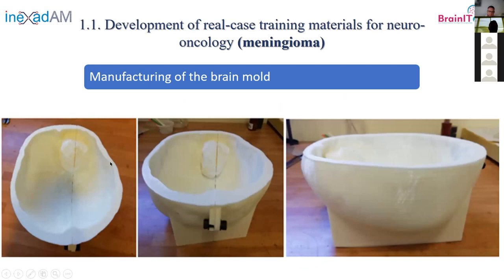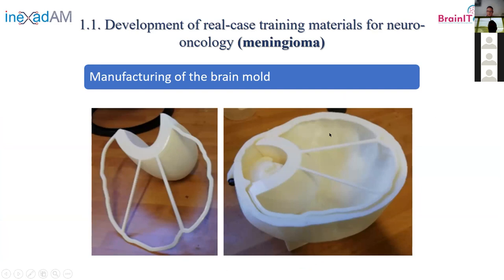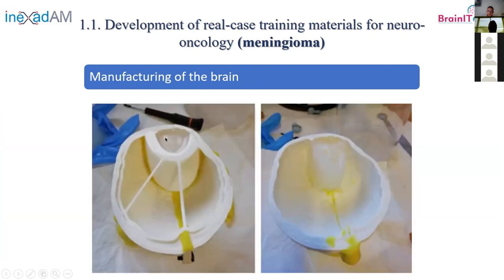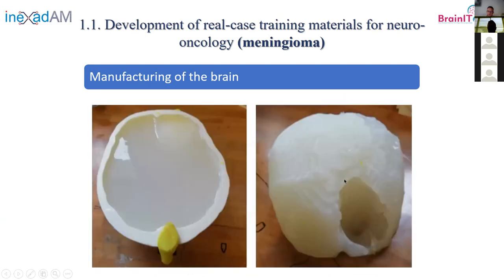We wanted to pour the softer silicone around the tumor and use the standard silicone for the rest, so we made this part of the mold. This is the brain mold in two parts, and you can see this additional part of the mold that allows us to pour the softer silicone. When that silicone cures, we remove the insert and pour the rest — the standard silicone. Here you can see the first pouring — the softer silicone surrounding the hollow of the tumor — and after the second pouring, this is the final brain without the tumor.